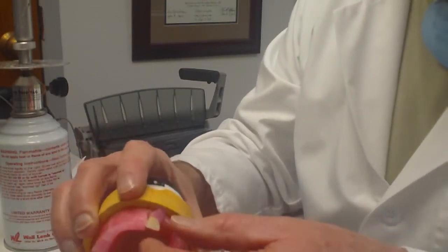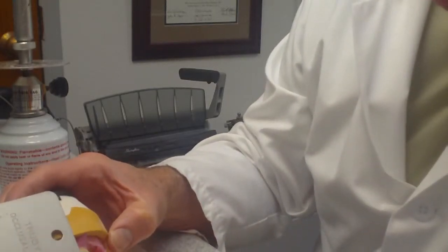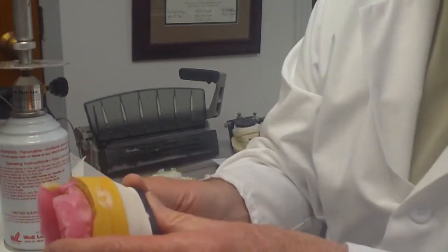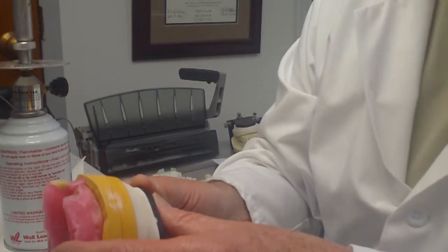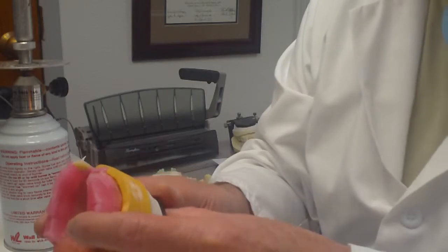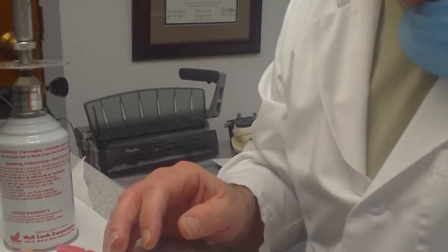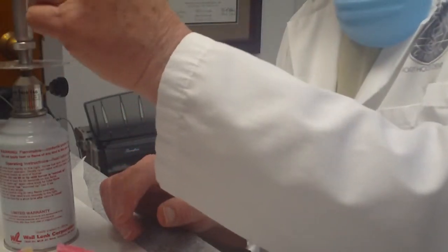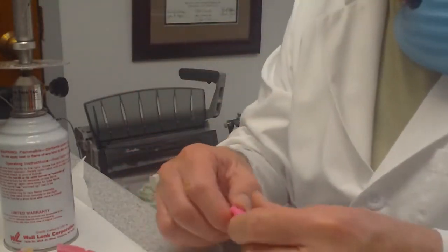So as you see, I rather quickly was able to place the central incisor. It appears to be in the midline. If you notice, it's also in the same plane as the wax rim that we contoured previously to help establish the position of this tooth. So that's one. So let's see what we do with the lateral incisor. Again, same methodology, just create a little wax root or a little wax tail, whatever you'd like to call it. Again, this assists in the positioning of the denture tooth.